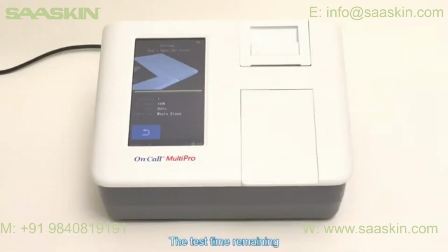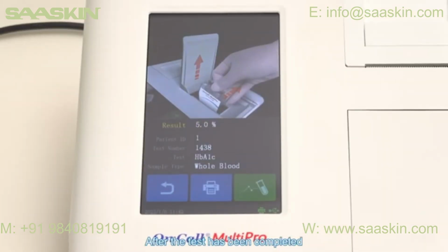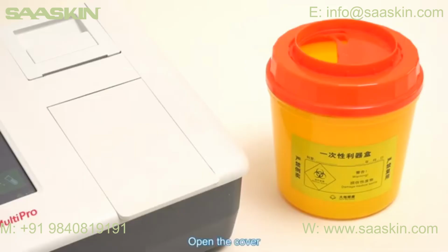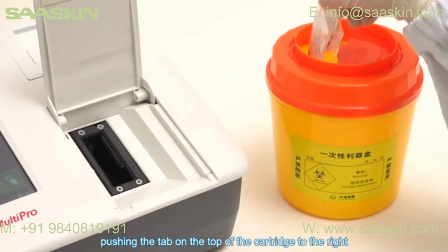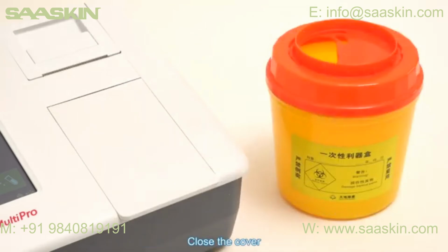The test time remaining and sample identification information will be displayed on the screen. After the test has been completed, the test results will be displayed on the screen. Open the cover. Remove the used test cartridge by gently pushing the tab on the top of the cartridge to the right. Then discard the used test cartridge. Close the cover.